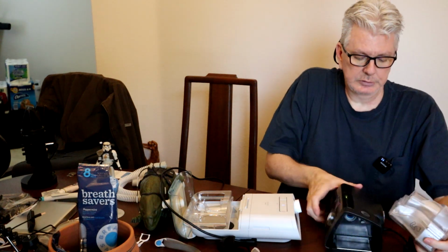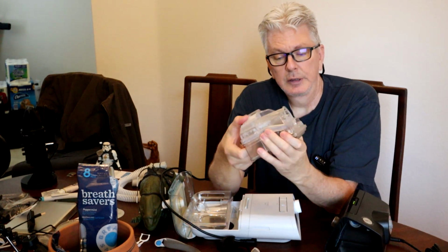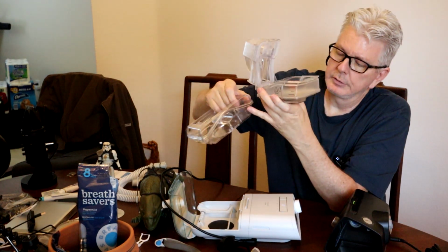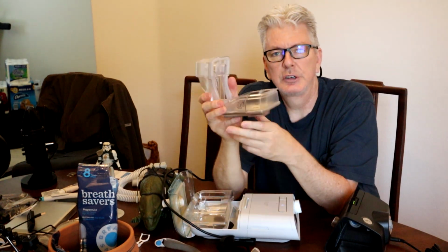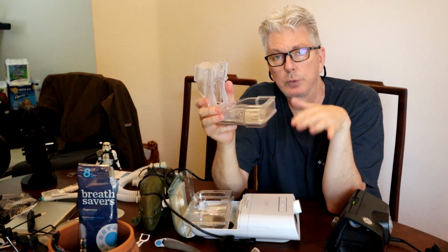Now this water chamber does not go in the dishwasher, so you have to empty it out, make sure and rinse it out, wash it out by hand. And what you do is there's a little lip here, you pull on it, open it up, and there you go. And they both have lines. You probably can't see, but they both have lines, water height indicators on each of these, so you know where the maximum is and not to overdo it.